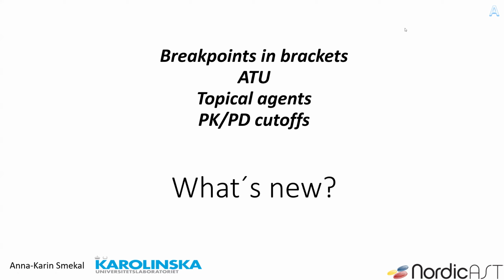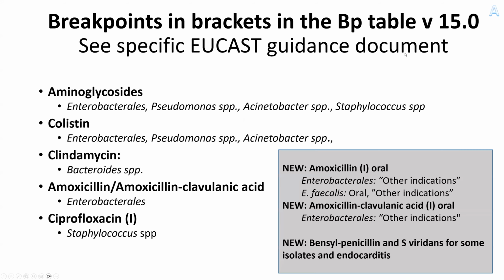Thank you, Karianna. I think we can go to the next slide straight away, talking about the breakpoints in brackets. Yes, so the species combinations with breakpoints in brackets in the breakpoint table version 15, you can see all of them here. To the left, we have the old ones that we already know about. And for version 15, we now also have some new breakpoints in brackets.